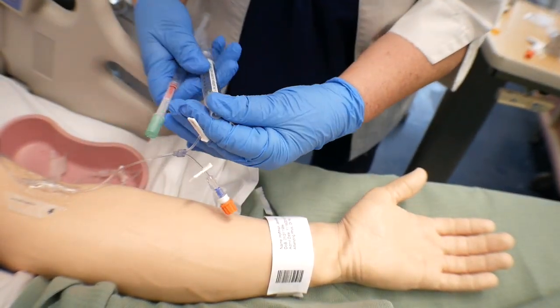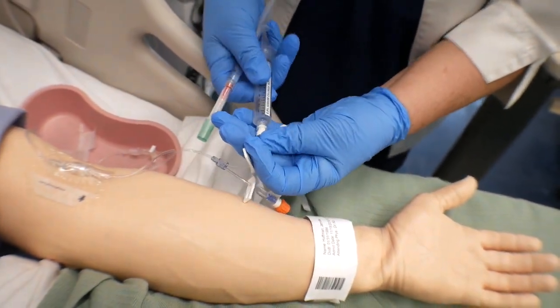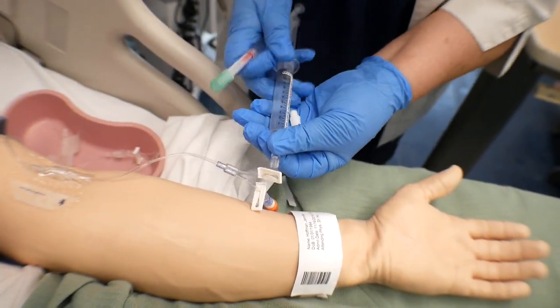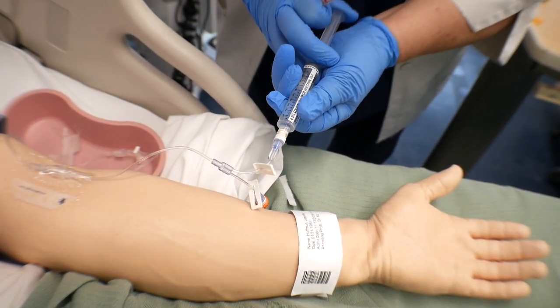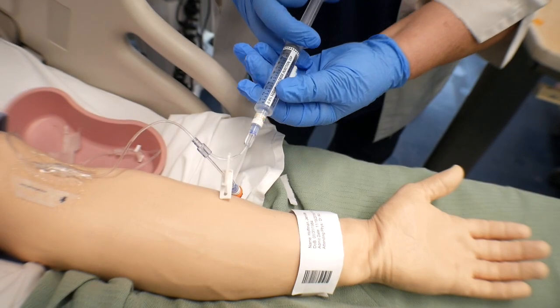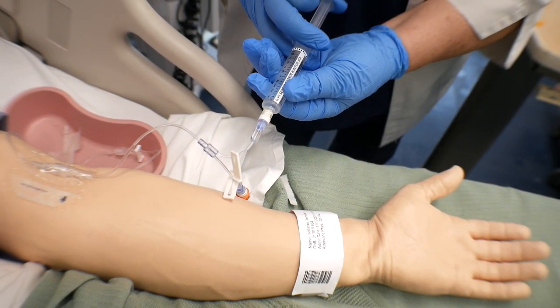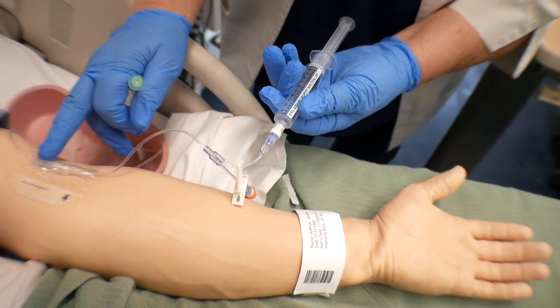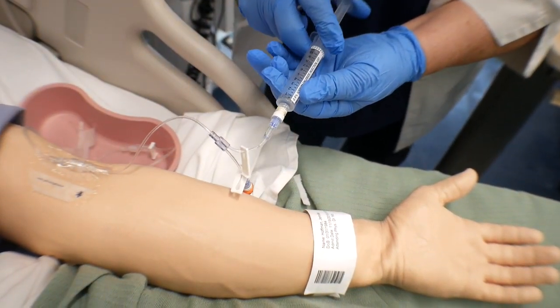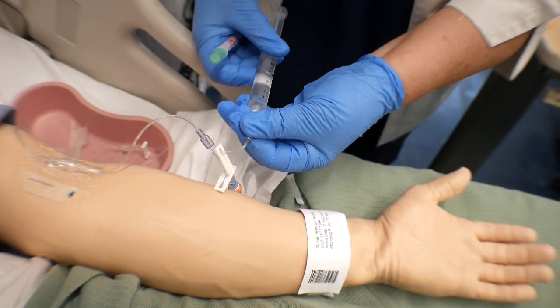And I'm going to check it with the saline, first of all. So I'm just going to push a small amount in to make sure that it's patent. Unclamp it. Mr. Smith, does it hurt when I push? I'm also checking to make sure it's not red, that it's not leaking, and that it flows evenly, easy, and no pain.